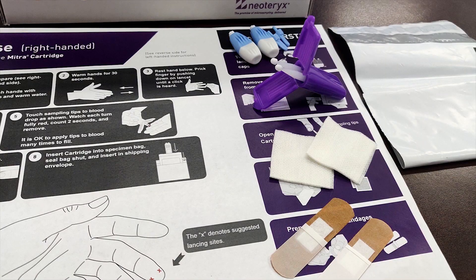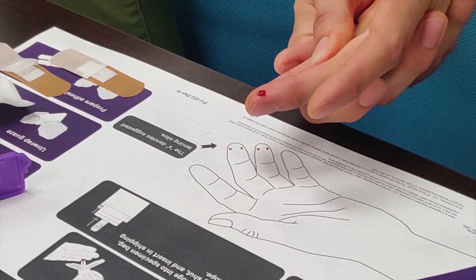Once your materials are ready, wash your hands. If after using the lancet you do not see any blood appear, or if the blood flow stops before you can collect a second sample, massage your finger from the palm upward to help blood flow. If you still don't see any blood appear, use another lancet on a different finger and try again.